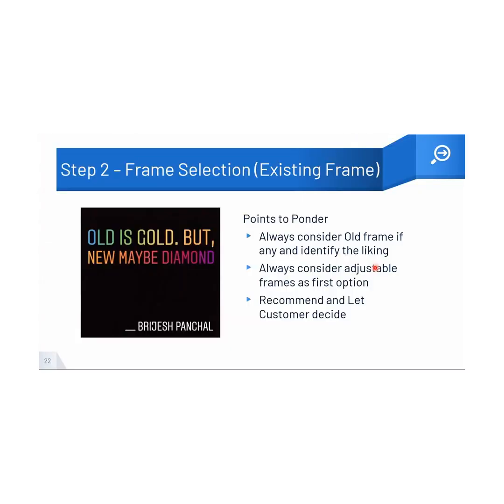Okay, so let us come to frame selection. Based on my past experience, this is a very common finding in optical practice these days. Clinical practice is still very clear in terms of the deliverables; mostly the focus is on the vision requirement.